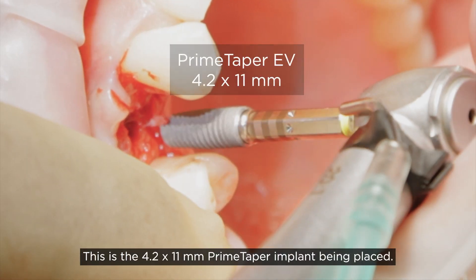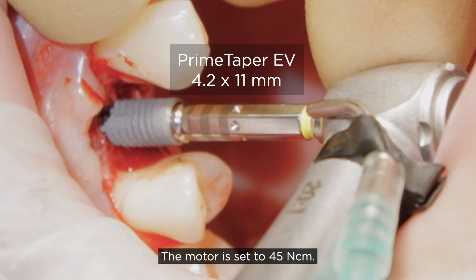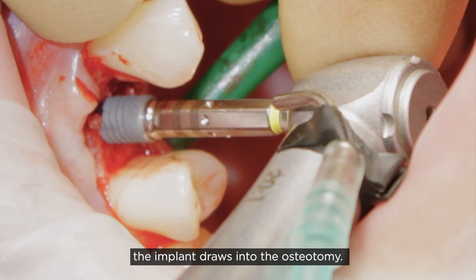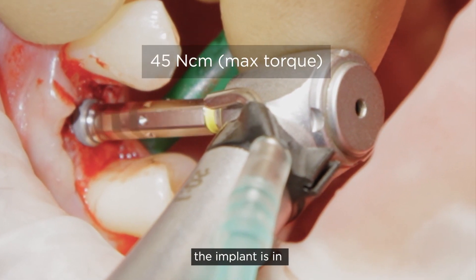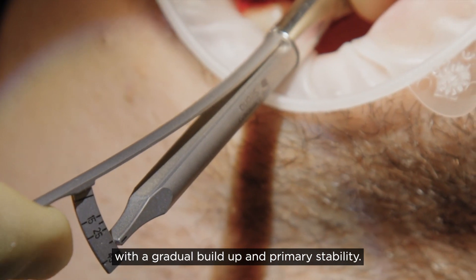This is the 4.2 by 11 millimeter Prime Taper implant being placed — the motor is set to 45 Newton centimeters. You can see how easily and nicely the implant draws into the osteotomy, and at the end of placement when we hit 45 Newton centimeters, the implant is in exactly the correct position with a gradual build-up in primary stability.